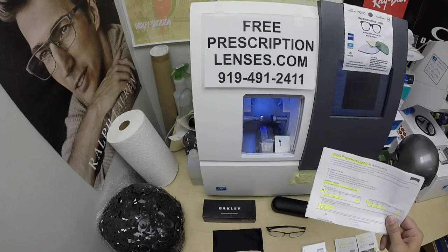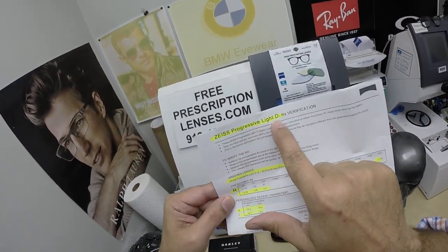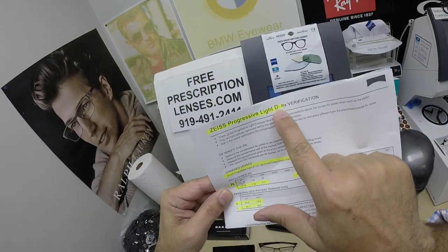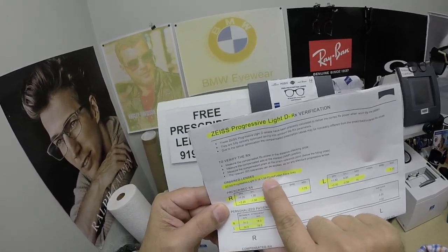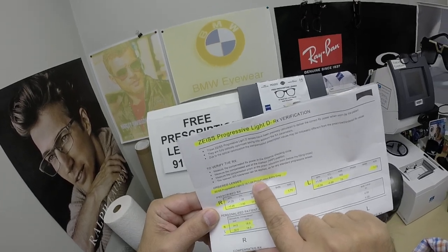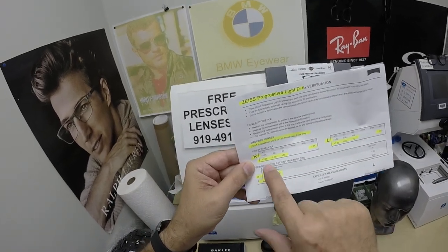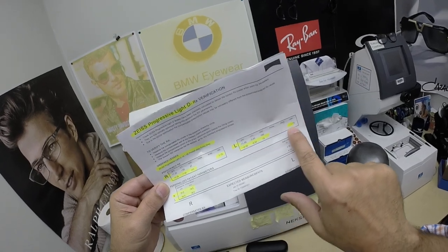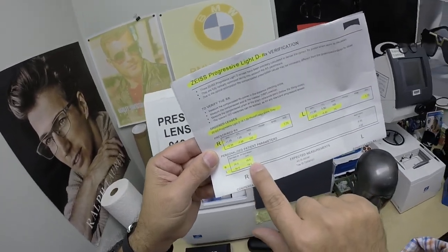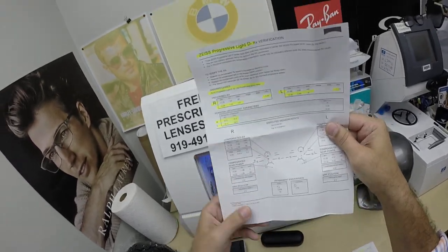Mohammed, by the way, this is about his fifth or sixth purchase from me over the years. He got the Zeiss Progressive Light D — as in digital freeform progressive lenses. He got the 1.59 refractive index, which is polycarbonate, Photo Fusion Extra Gray, and the DuraVision Silver anti-glare treatment. I've highlighted the prescription for the right eye: progressive power, same for the left, pupillary distance, and optical center height.